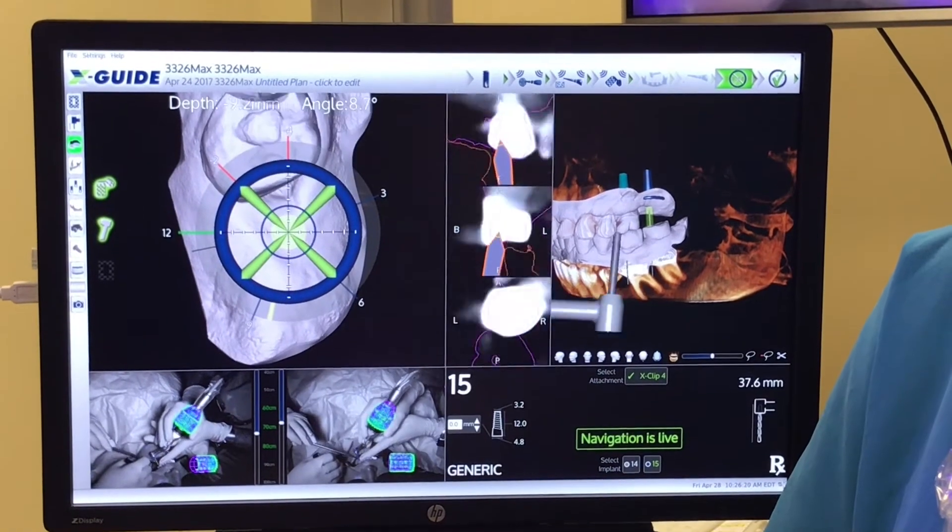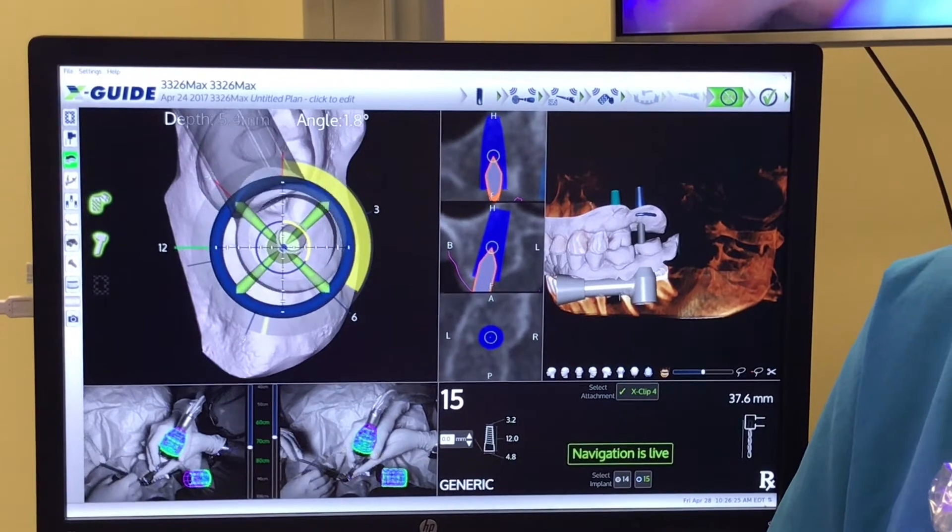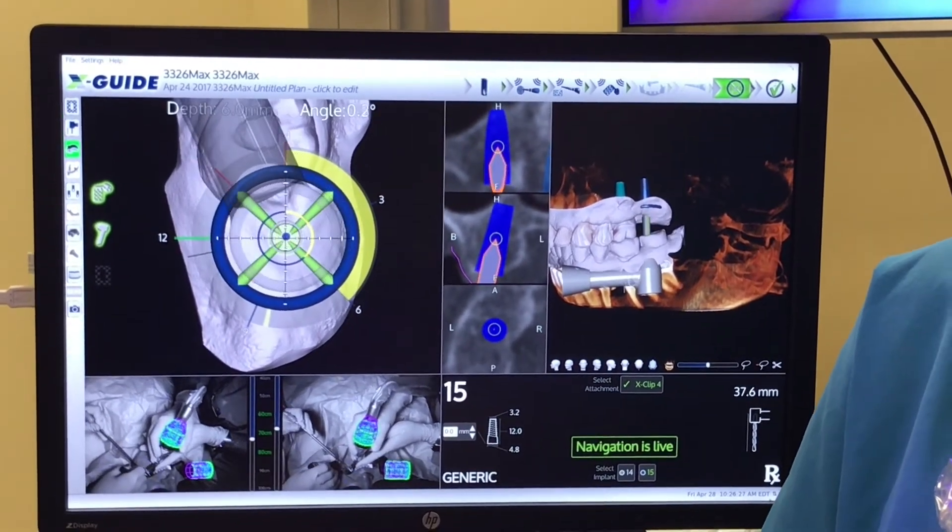We're then going to select the other tooth, do a quick system check, which only takes seconds. We then center the drill over the target.